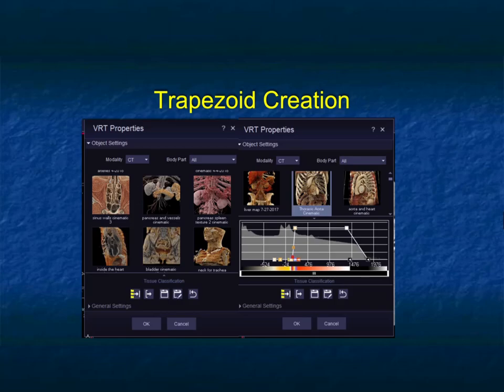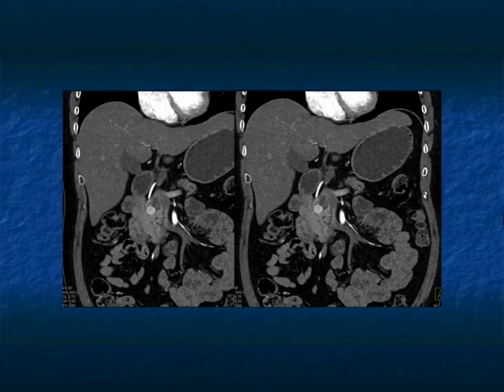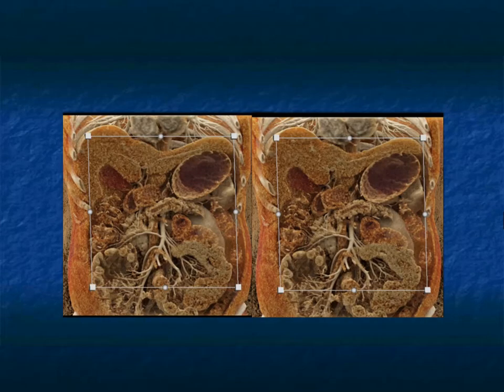And what we've done is create presets to make our work faster, where I could do most cases in well under 5 minutes. But it's the presets, and I have probably 20 presets for the pancreas, depending on what I'm looking for, depending on the size of the patient, depending on the injection rate, and many other factors. But we're able to look at, so for example, in this case, you can see a 1 centimeter vascular lesion in the head of the pancreas, which is a neuroendocrine tumor, easy to see on the coronal views as well, near the GDA. You can see small vascular lesions in the liver, which means this patient also had liver mets, though they are very tiny, a good reason to look at MIP imaging. And on venous phase imaging, the lesion is less well defined, but it's still easy to recognize.